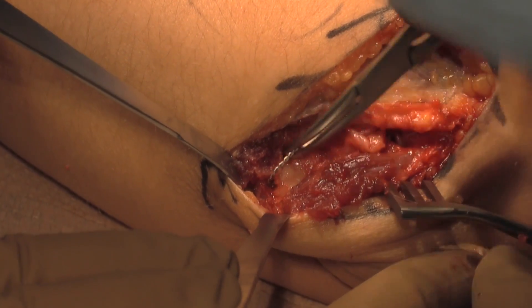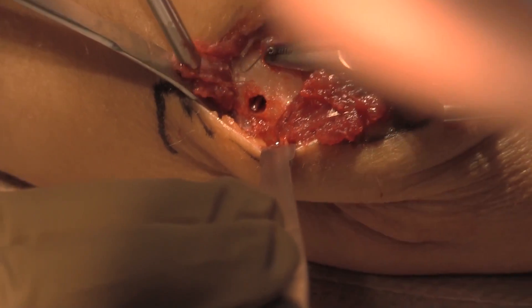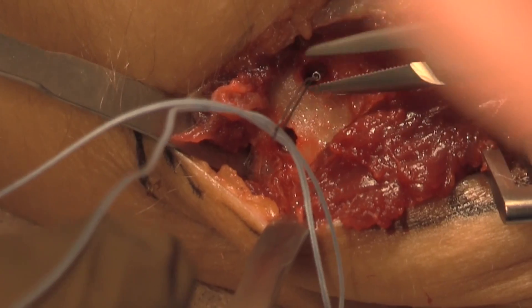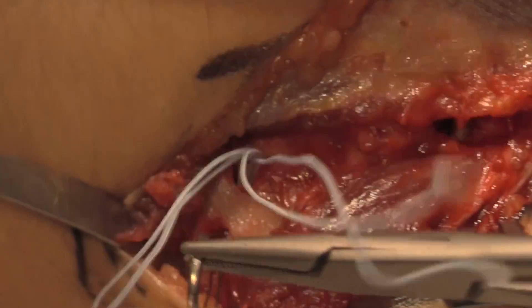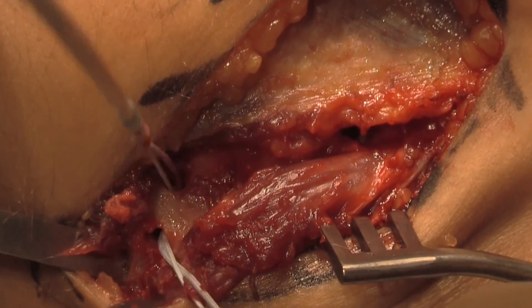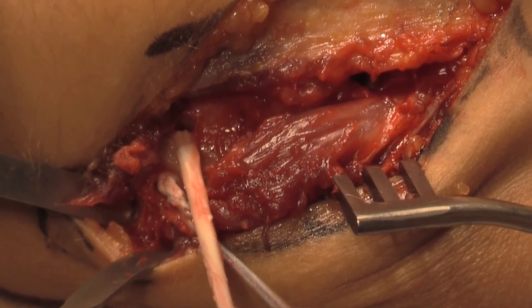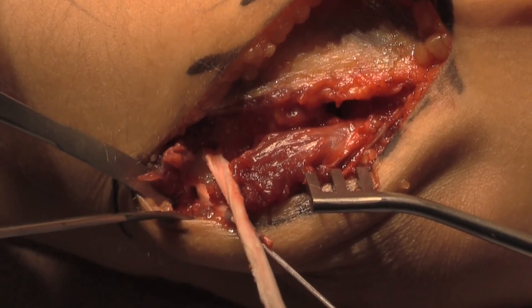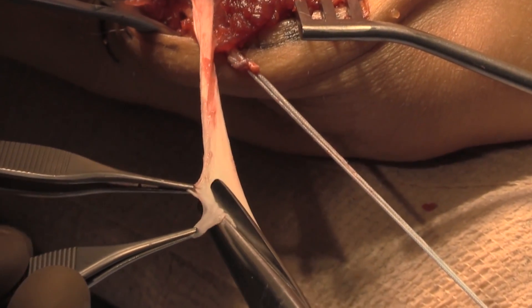A suture shuttle is used through the drill tunnels on the ulna to pass the allograft gracilis tendon that was prepared on the back table, as seen here, sized to pass through a 3.5 millimeter drill tunnel distally. The ends of the graft are trimmed to allow smooth passage through the tunnel.